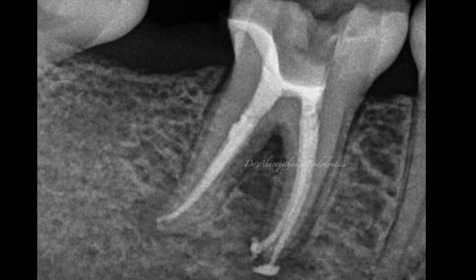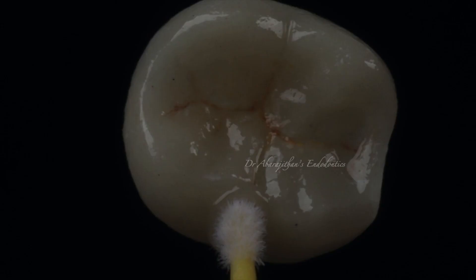You can see some sealer extrusion, which was not intentional and is not advocated, but it is bound to happen in bioceramic obturation technique, especially in cases with lesions where there is a well-established patency. This cracked tooth was later restored with a bonded restoration.